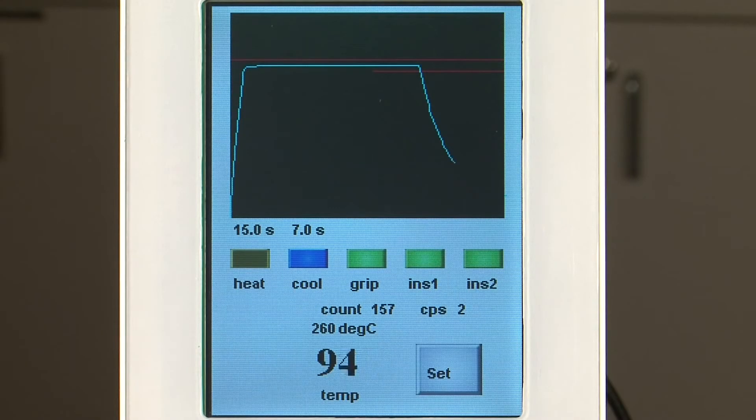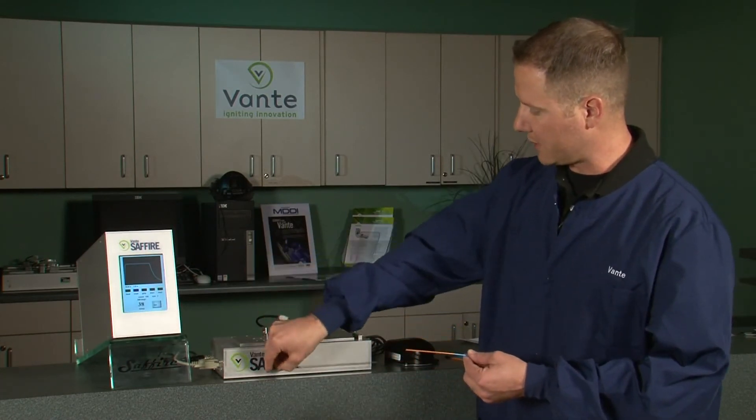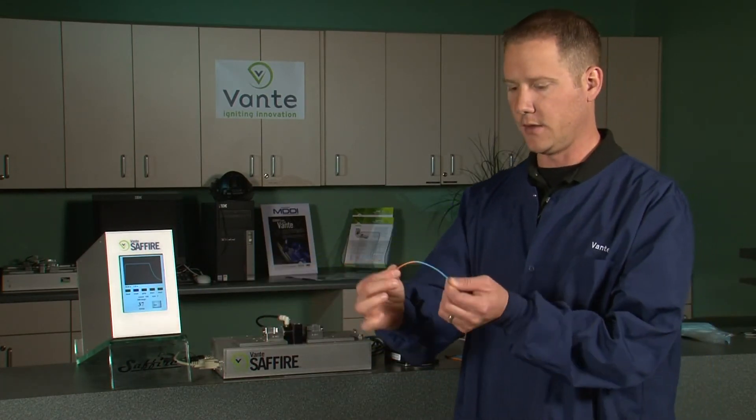As a very small heat zone of about 10 thousandths, you have 15 seconds of heat and seven seconds of cool. Your operator would remove the part, remove the mandrel, and there's your weld.